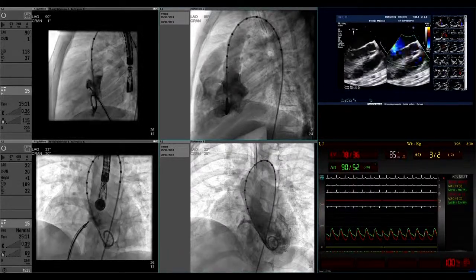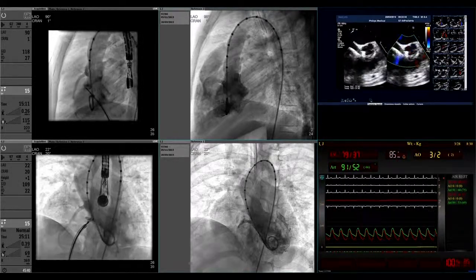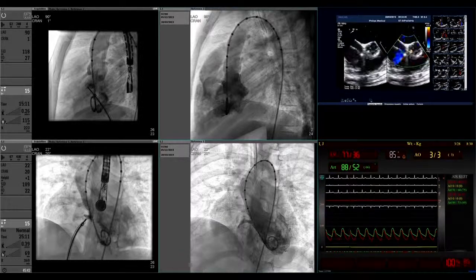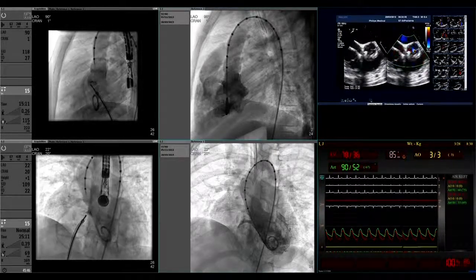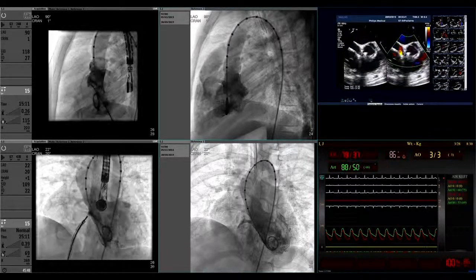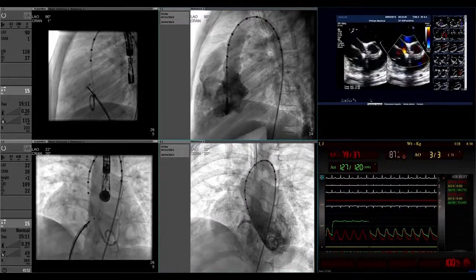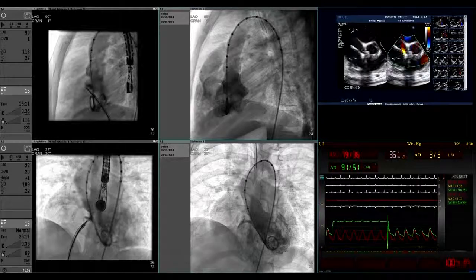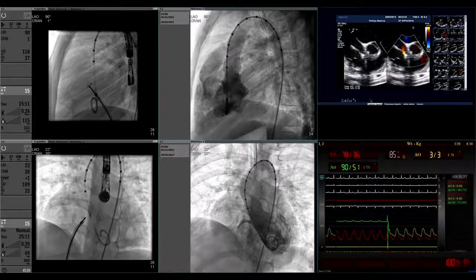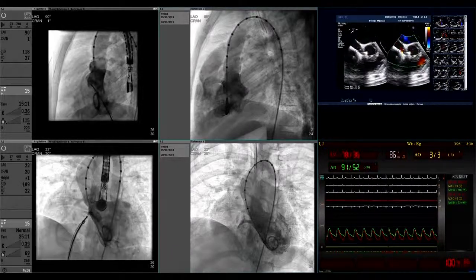Tin, Dr. Bharat has got a question for you. Yeah. The length of the VSD, I think, is a matter of concern. And embolization on the aortic side is not uncommon with such VSDs. Many times when the ADO1 is on the cable, you see the waist and you find that the lie is excellent, but you will see the amount of recoil once you release it. And things may not look the same after release as they look when you are on cable.